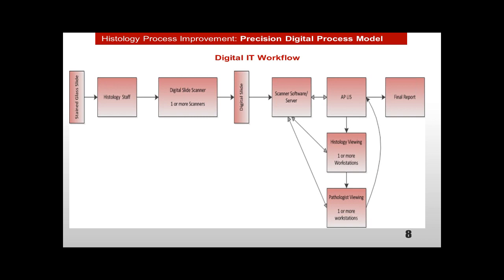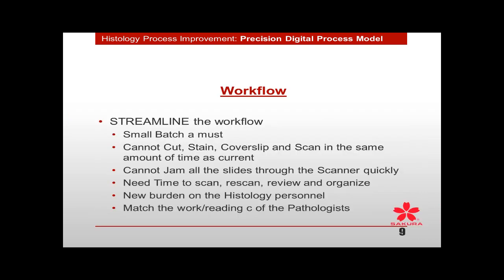We won't even get into the different companies out there and the different times of scanning, but these are not going to be a minute or two of scanning. These are going to be sometimes many, many minutes per slide, depending on at what level and what you want to do with those. So time factor can create chaos in your histology and blow up your whole process. I can't impress upon you how much more effort and time histology is going to have to be involved here. So again, those other workflows were just simplified.